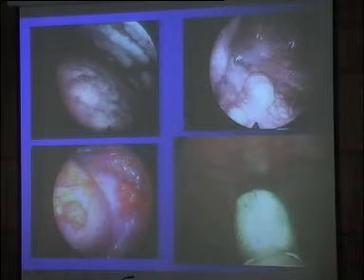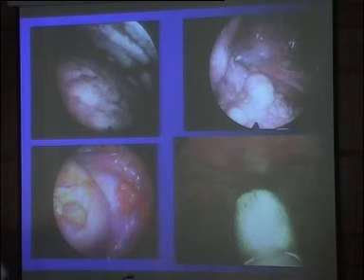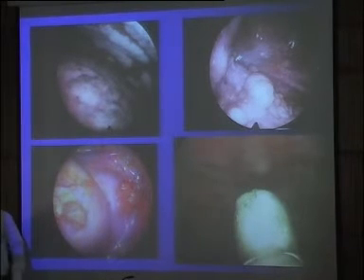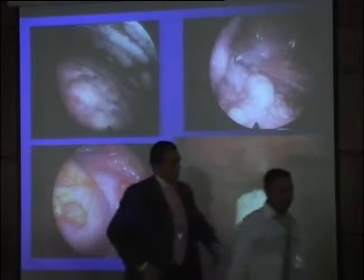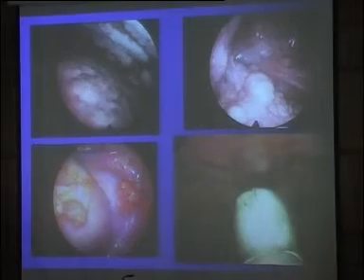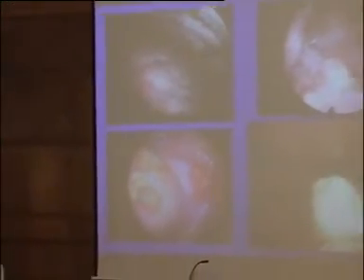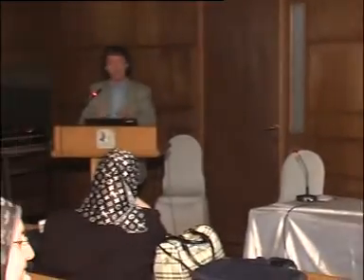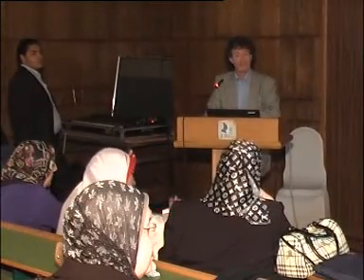Absolutely. Why? Because if you are on the back, when you enter into the pleural cavity you are in front of the anterior parietal pleura, and in this area you have the internal mammary vessels, etc. Second, there is no stoma and no lymphatic at this level. They are on the back. It's the reason why we are facing the patient, in order to be in front of the posterior parietal pleura when we enter the pleural cavity. You understand?